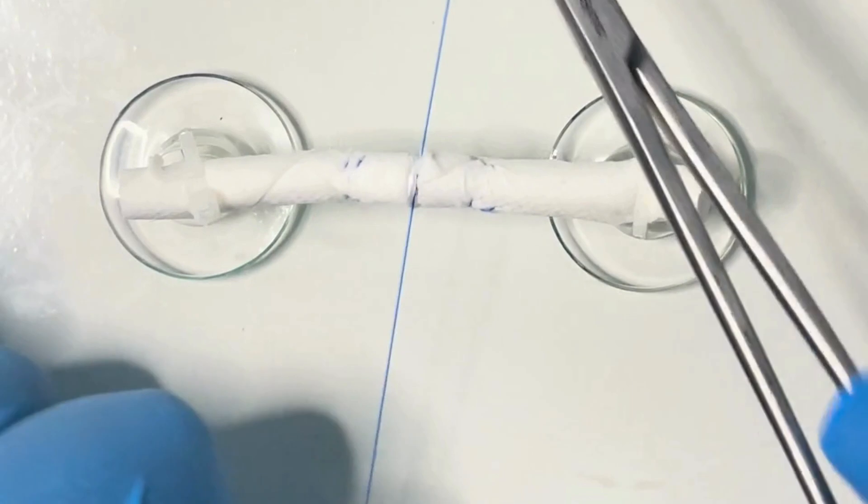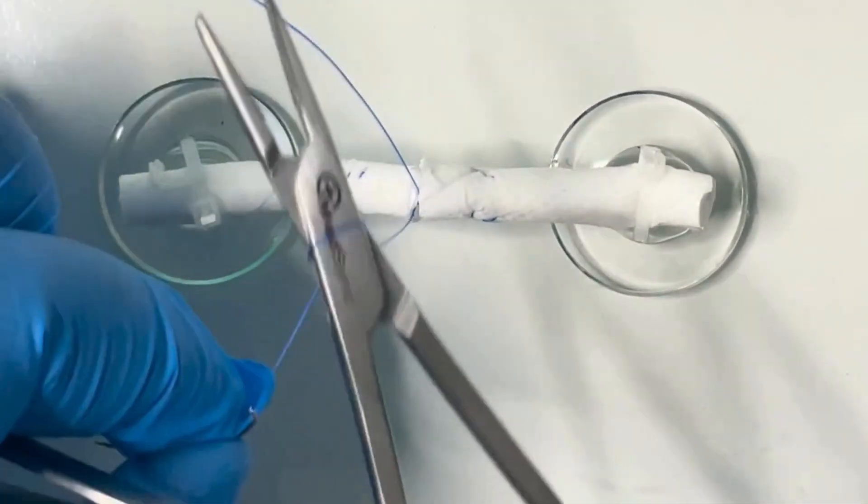As this is a monofilament suture, you need to tie between four and six knots.